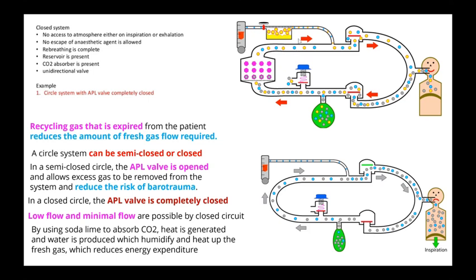And there is a volatile anesthetic agent being delivered to the patient through a vaporizer. So the vaporizer is also not here. Here only you can see the fresh gas flow, vaporizer absent. So in those days you get two pictures looking similar, find 6 differences. Like that you have to be observant and find out what is the difference between these two.